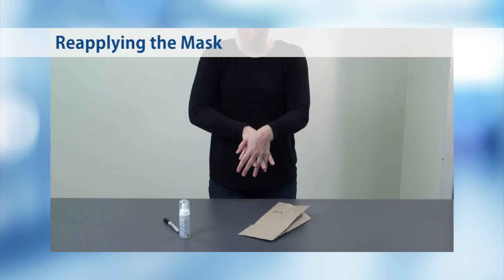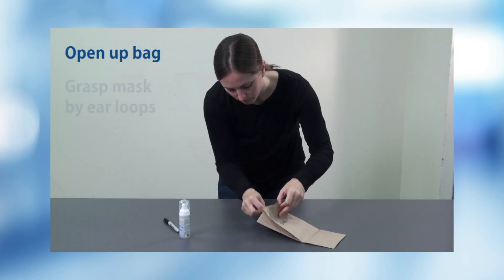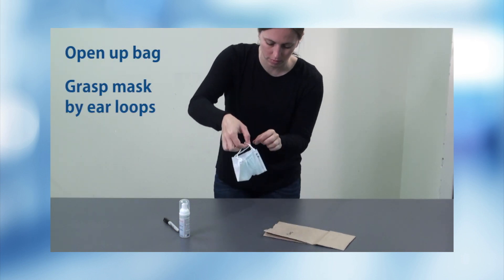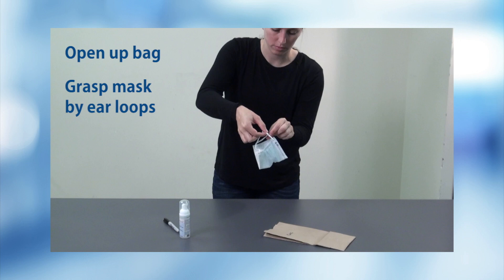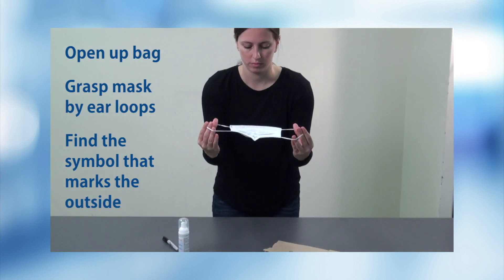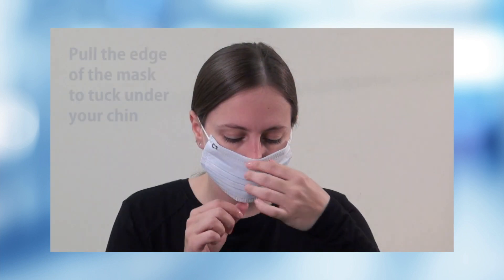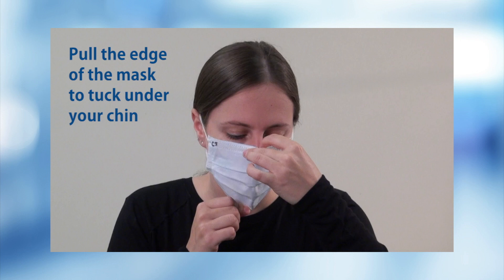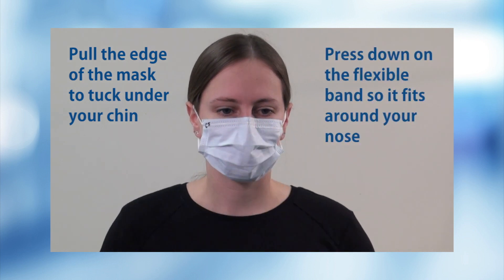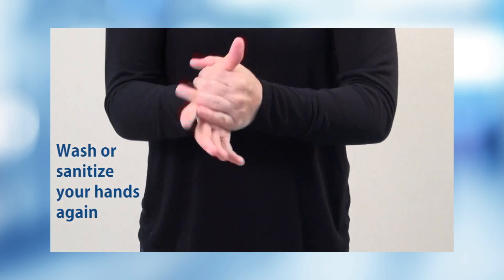When reapplying the mask, wash or sanitize your hands. Open up your bag and grasp your mask by the ear loops. While it's dangling from your hand, find the symbol that marks the outside of the mask. Then, with the symbol facing out, pull the ear loops over both ears to put on the mask. Pull the edge of the mask to tuck under your chin. Press down on the flexible band so it fits around your nose. Wash or sanitize your hands again.